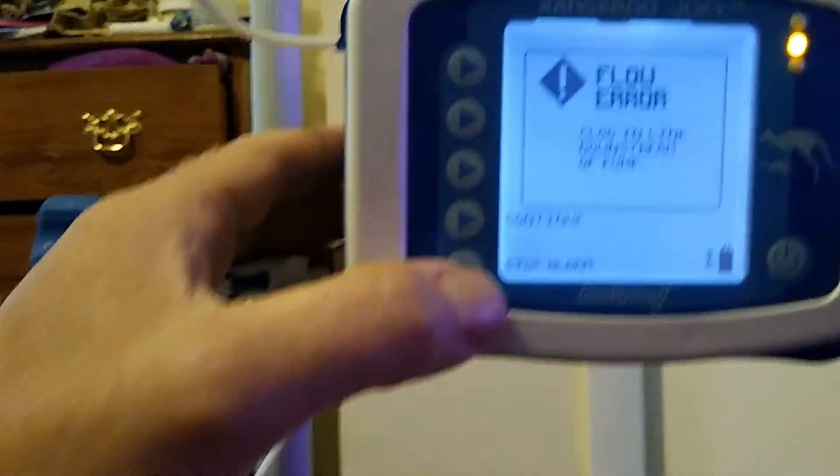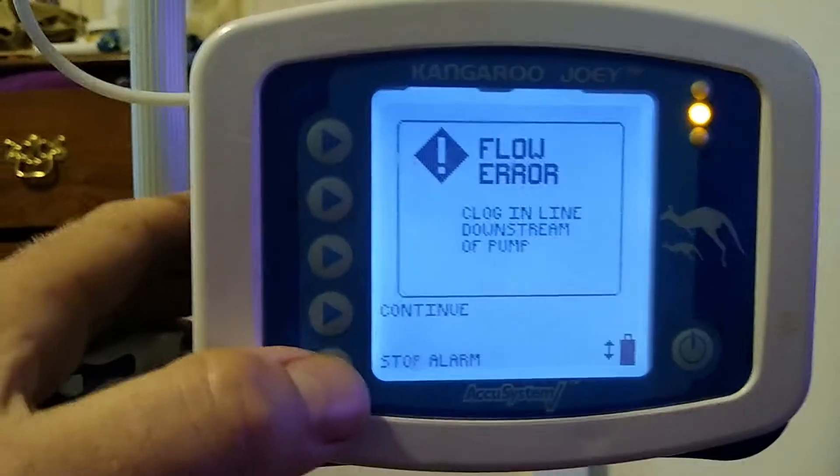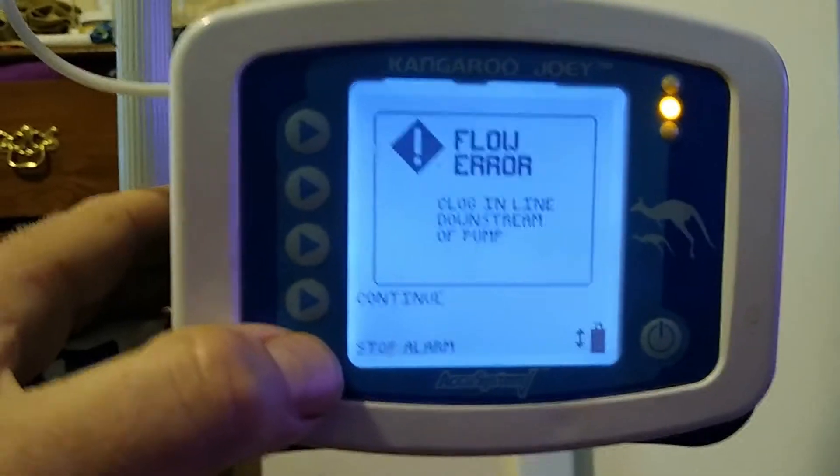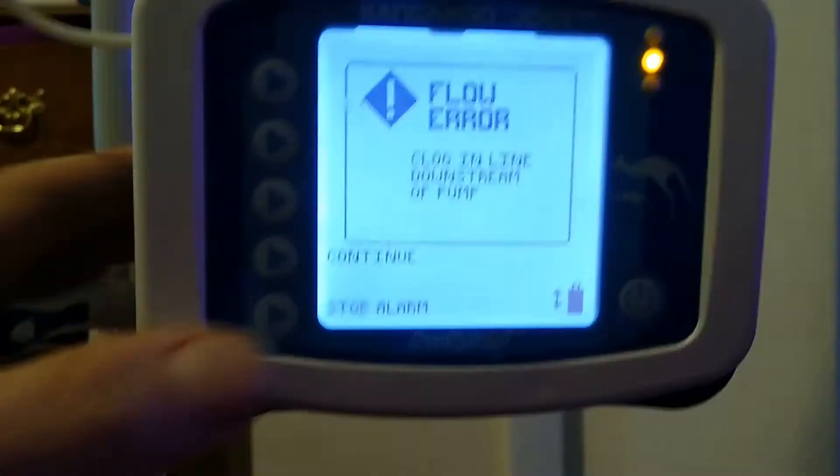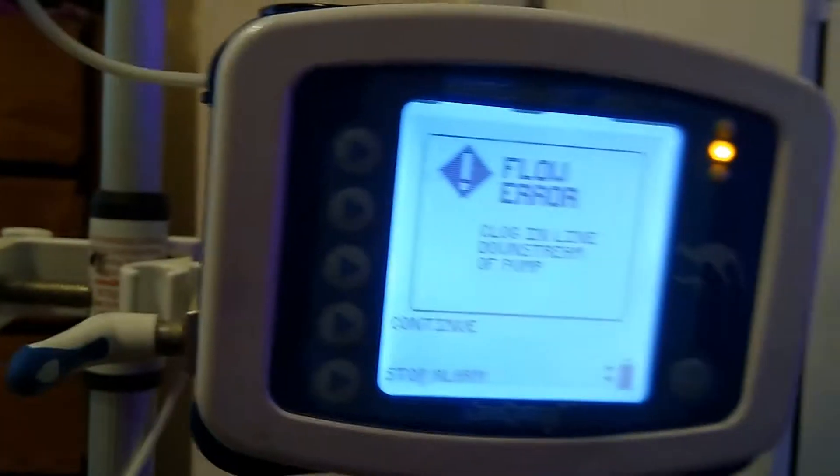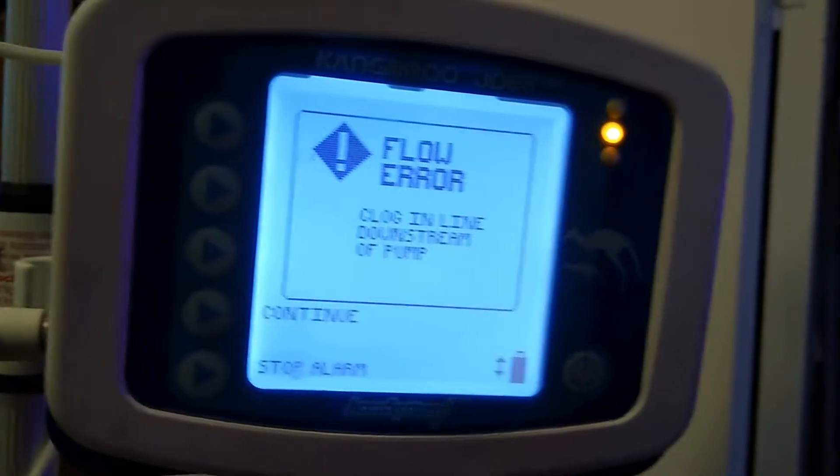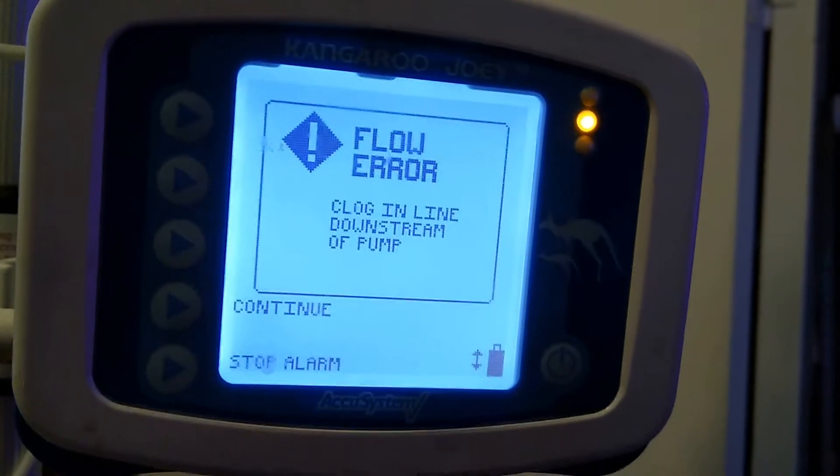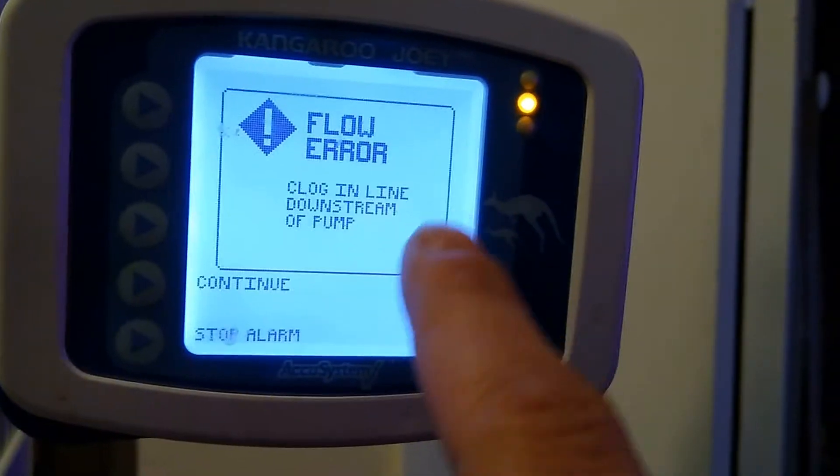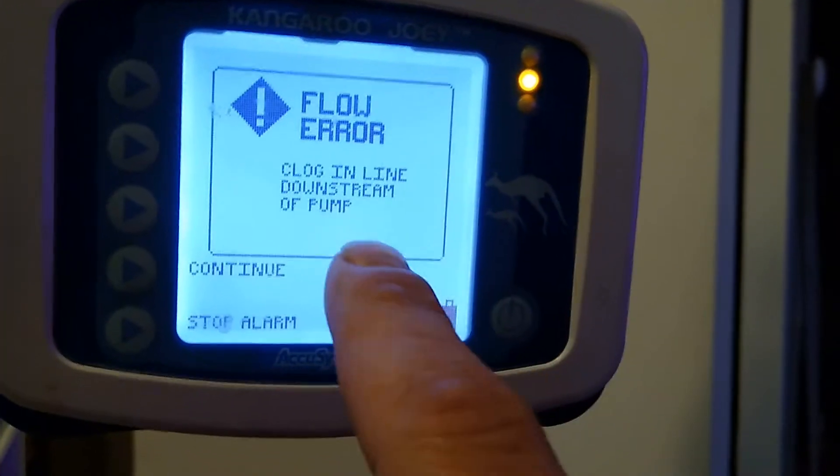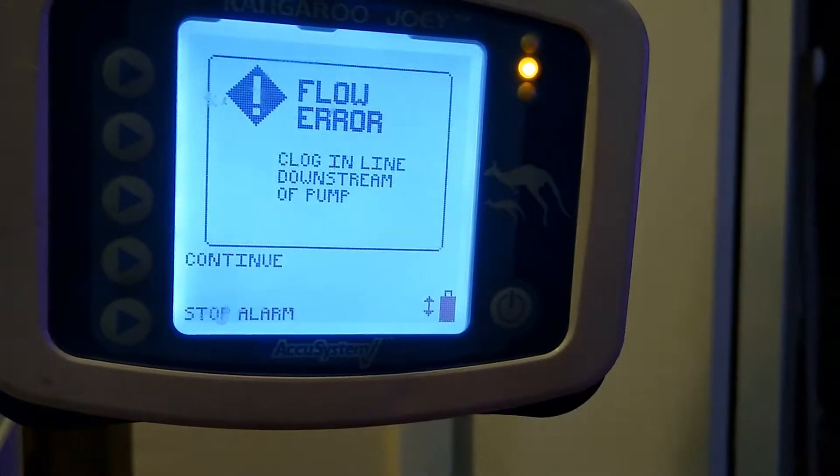What's going on everybody, let me stop this alarm. Today I'm going to show you how to fix the Kangaroo Joey clogging the line downstream.